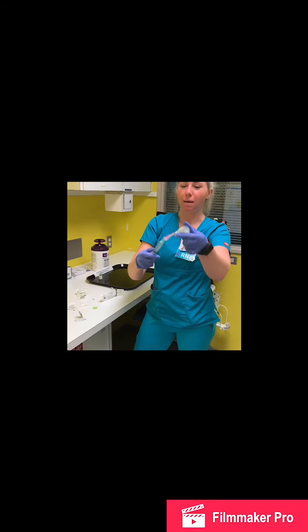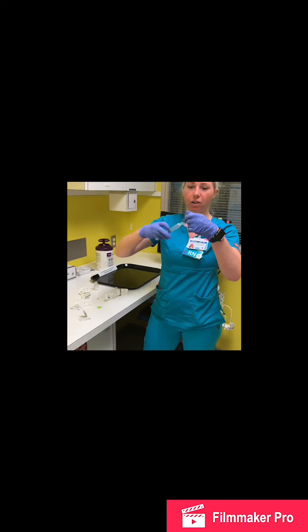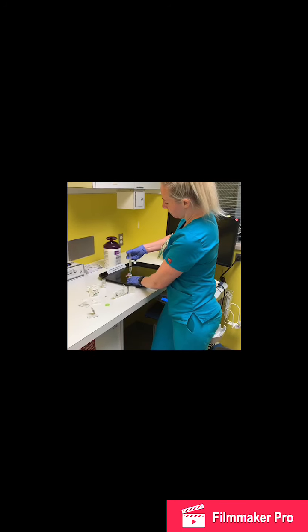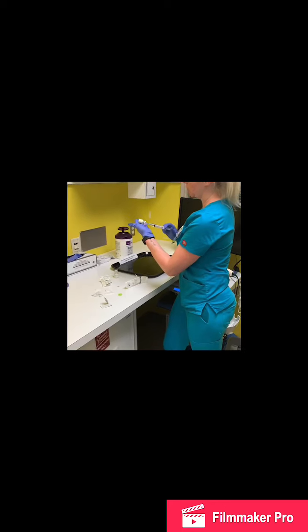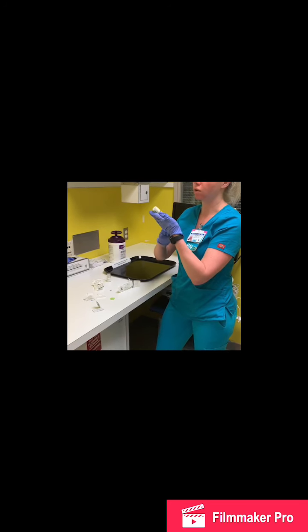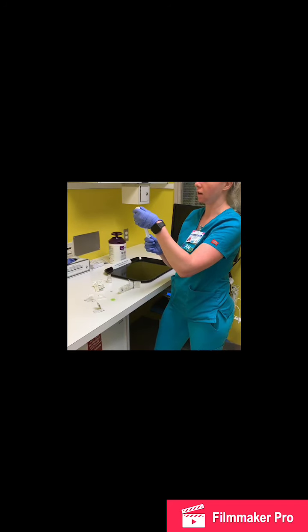I'll then withdraw my needle, and I'm going to place the diluent into my medication. So I'll inject in, placing it down on a nice firm surface, filling up the vial. I'm then going to gently roll the medication. I'm not going to shake it, just gently rolling until it's all dissolved. Then I'm going to withdraw my medication out of the vial.